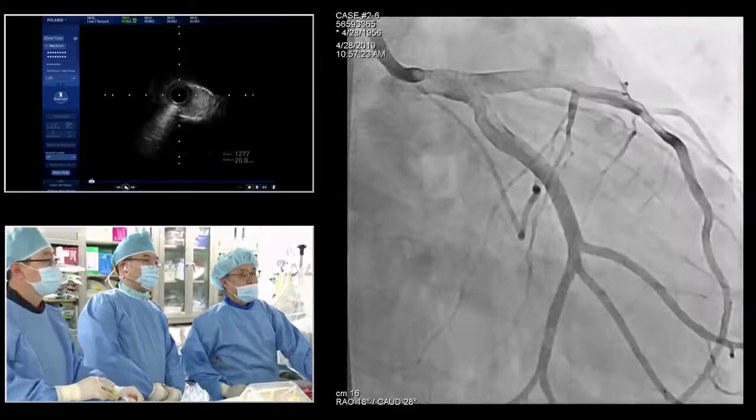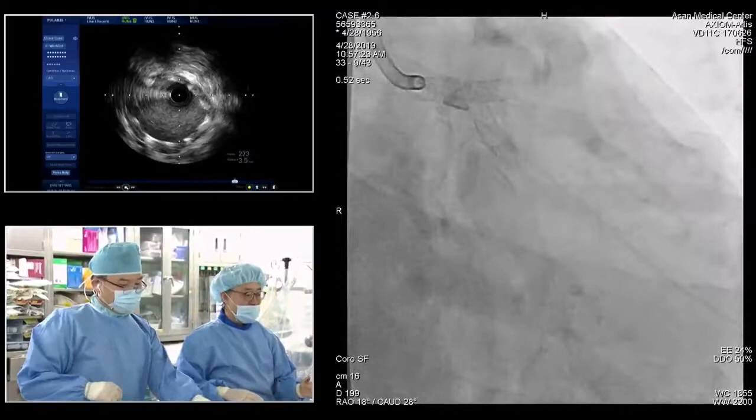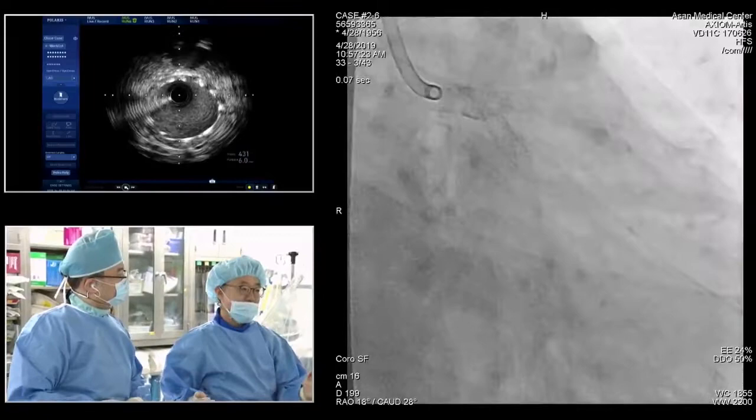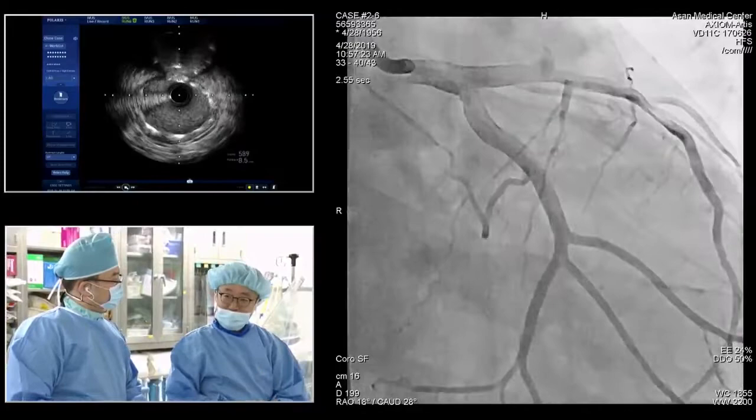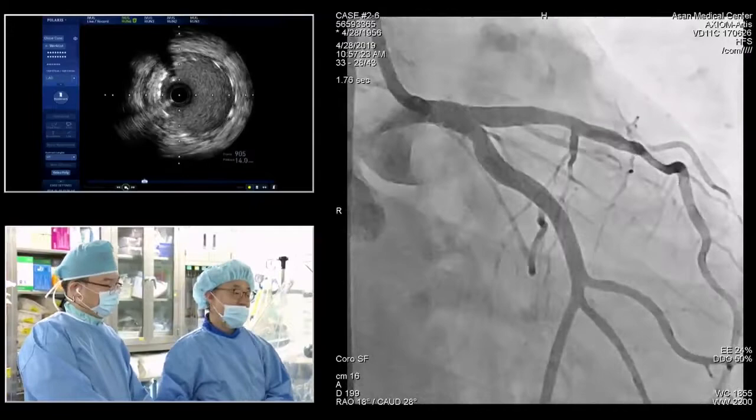This case has some interesting, debatable points, which strategy is good for this patient, 101. I'm very happy to show our routine practice of left main PCI. We definitely, 100%, based on the intravascular ultrasound, decide the stent length, stent size, and frequently decide our stent strategy. I think this case is typical, a representative case, Asan Medical Center, left main PCI.